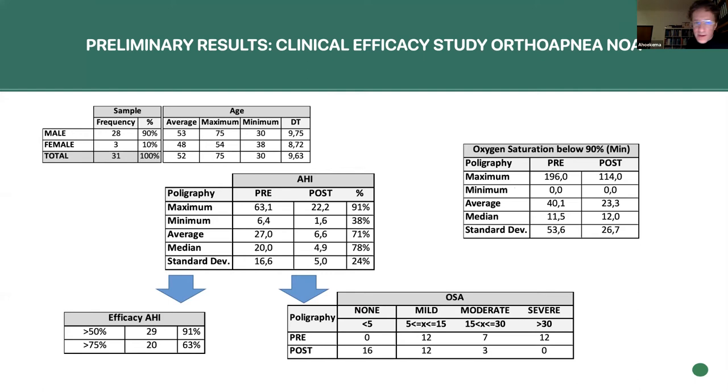There is one question: whether there's evidence that suggests that the customized pattern of opening guided by the cam results in better efficacy or more comfort to the patient. That is the specific question one of the attendants poses: what is the evidence that the specific features that the NOA offers result in more efficacy and comfort? So far there are no randomized studies, and I think that's the background of this question. Could you comment on that?